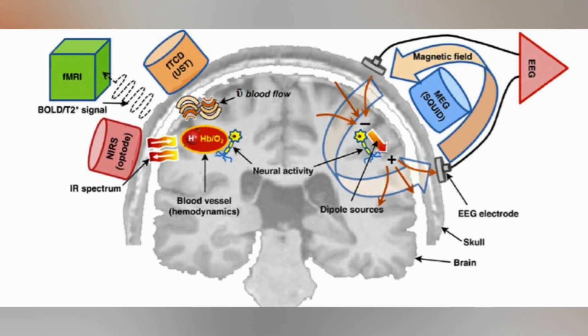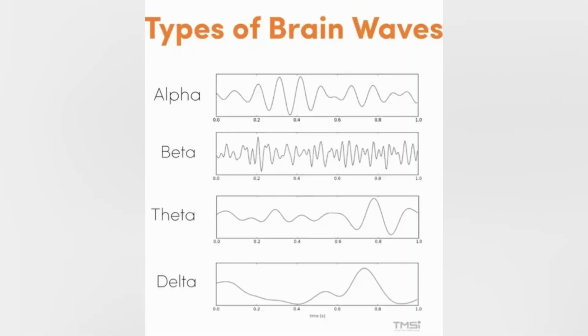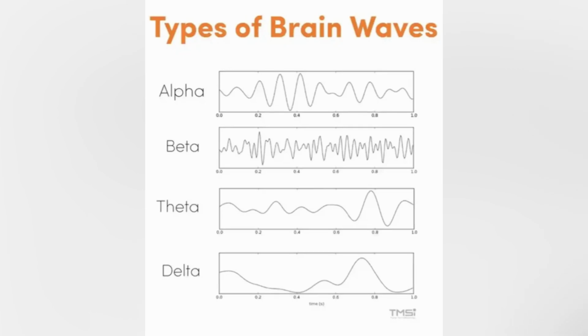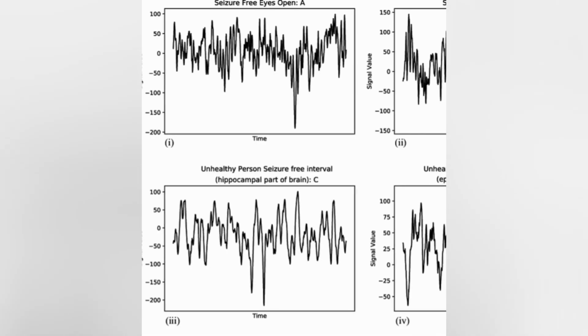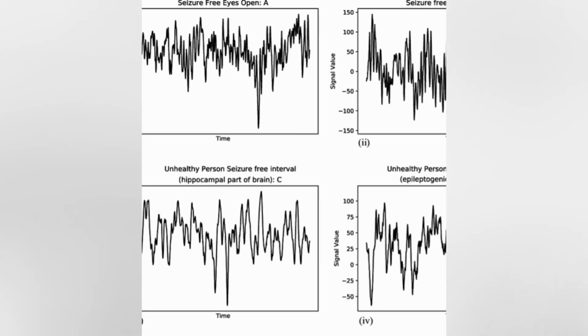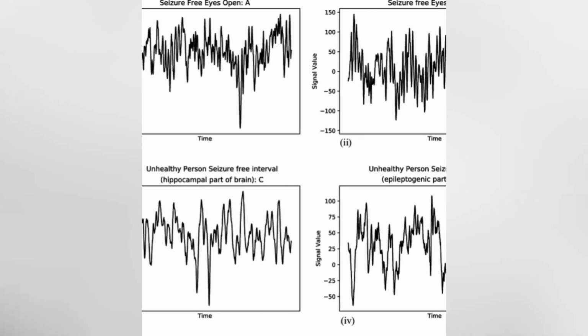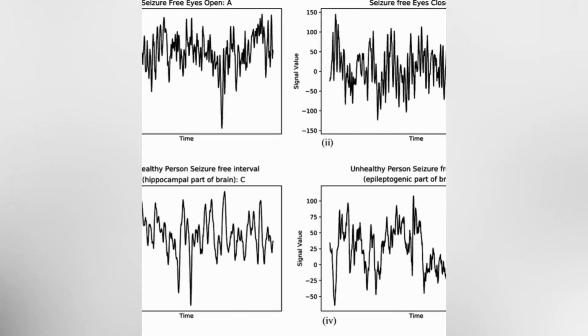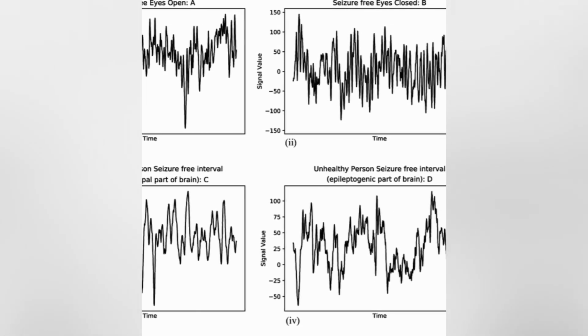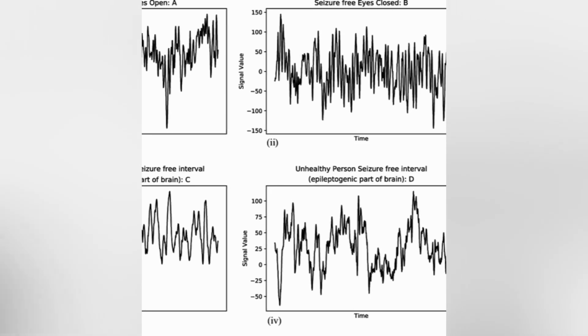And based on the speed of rotation, different brain wavelengths and, therefore, electrical signals can be measured. The machine then traces these electrical signals onto graph paper by moving beneath them and drawing the waveforms with an attached pen. Furthermore, the resulting graph on either the EEG machine's screen monitor or the attached paper graph can reveal different brain functions according to changes in time and space in solving cognitive tasks and motor and perception abilities given to the patient to do by the healthcare professional.